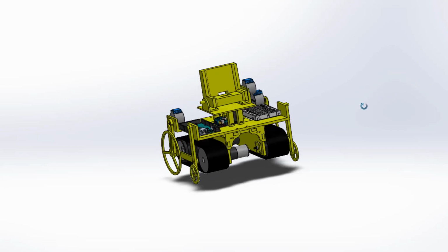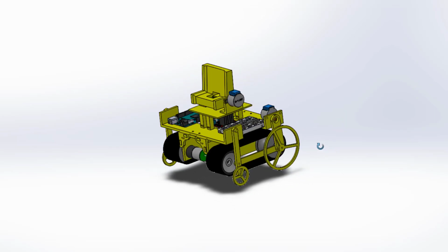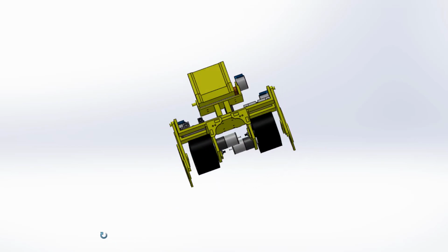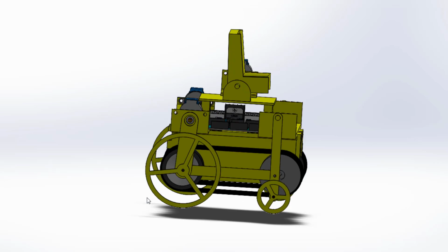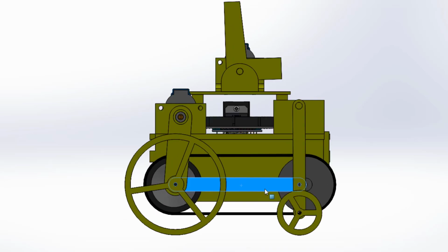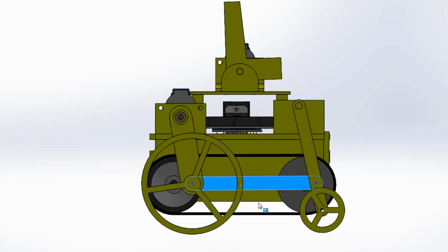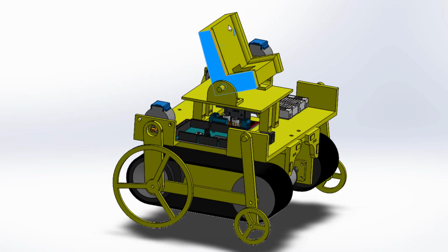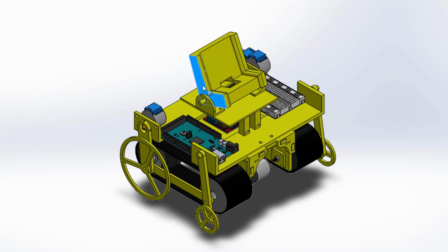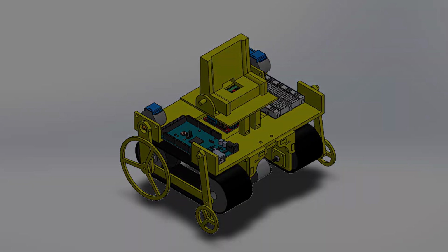The 3D design of the prototype was first created in the CAD software called SolidWorks 2020. The components of the prototype and the standard parts such as the fasteners were determined. The prototype was designed with a modular assembly because it consists of different functions. It will be easier to upgrade and improve on certain functions of the modular assembly design.